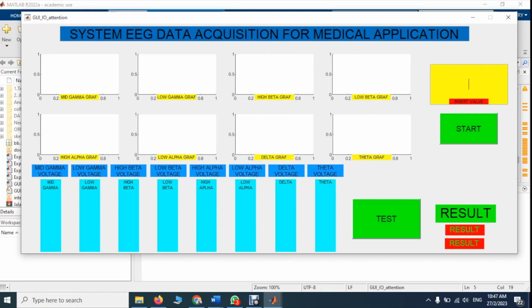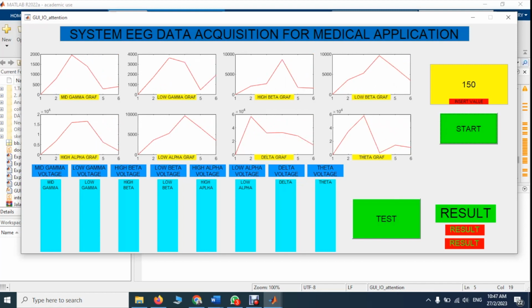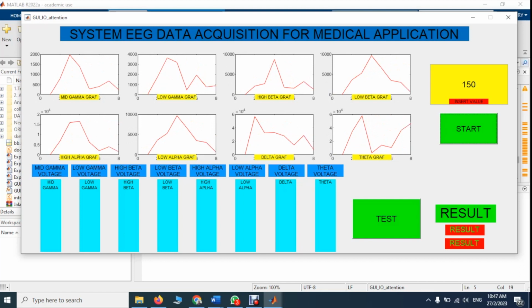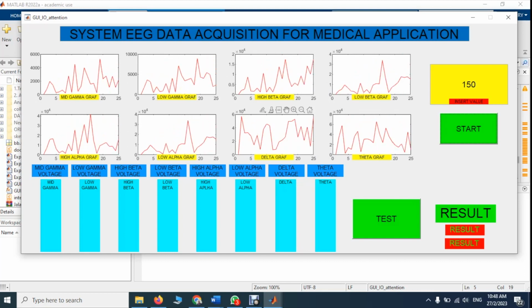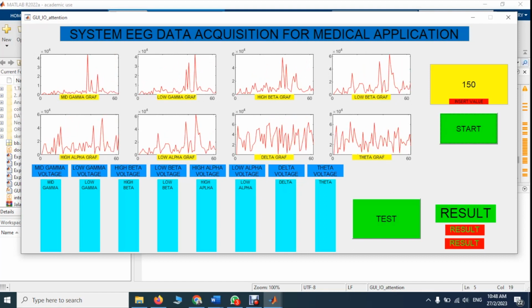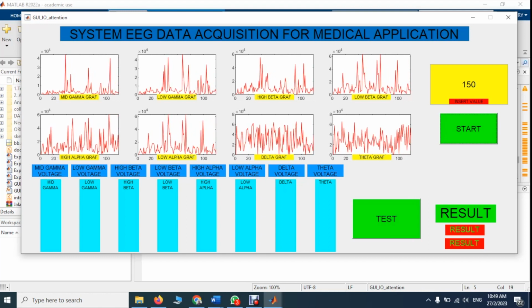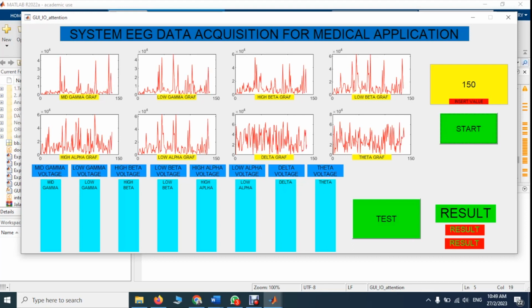The University of Bonn in Germany assembled a publicly accessible dataset called the Bonn Epilepsy Dataset. The part of an EEG dataset used to train a machine learning model is often referred to as the train section of the dataset. The results found that normal and abnormal results were successfully displayed on the GUI software, which took 20.86 seconds for 20 data, 50.73 seconds for 50 data, 1.42 minutes for 100 data, 17.10 minutes for 1000 data, 51.18 minutes for 3000 data, and 4097 data took 67.18 minutes.